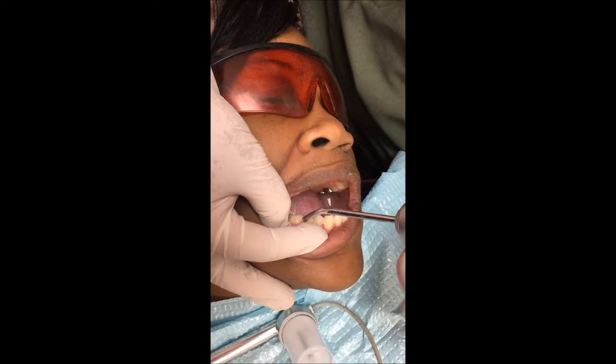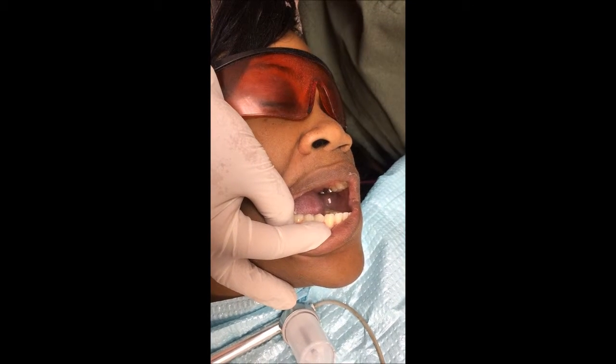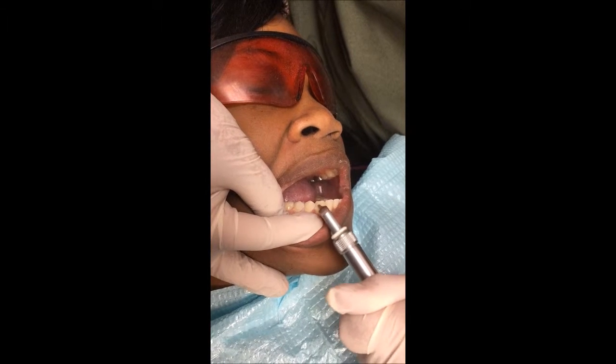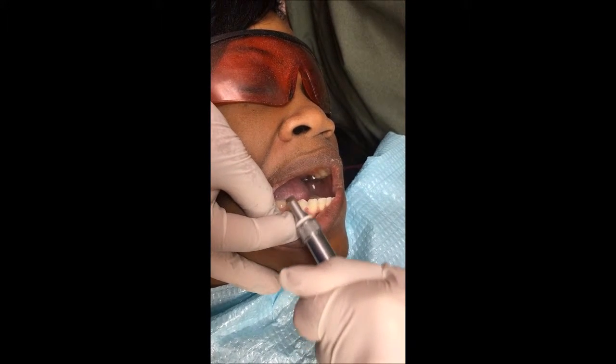First, we're going to dry the teeth. In the next step, we're going to etch the teeth — that's the canine, the first premolar, and the second premolar.